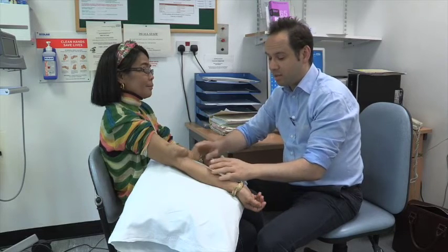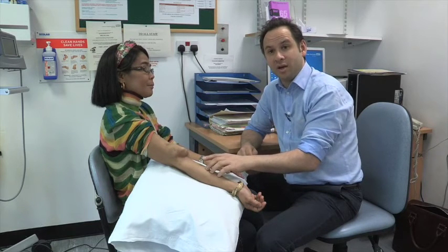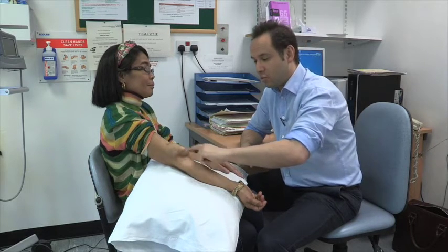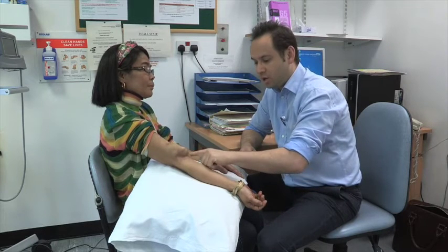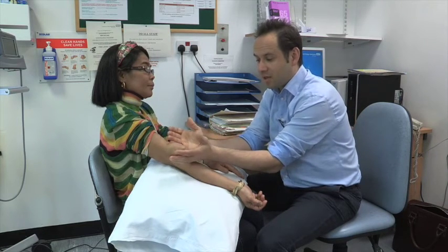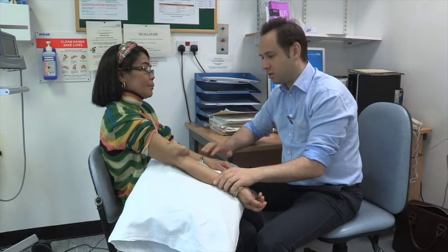This lady has got a functioning transplant and actually doesn't need to have this fistula anymore. My aim is to operate on this — it's a short general anaesthetic — remove in its entirety this fistula, and reconstruct the artery that's providing blood to the fistula. Then do a little bit of plastic surgery and bring the skin together. All being well, we'll have the arm back to normal again, exactly like the other arm.